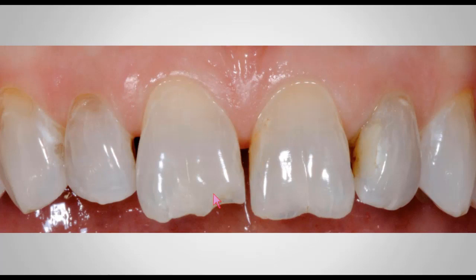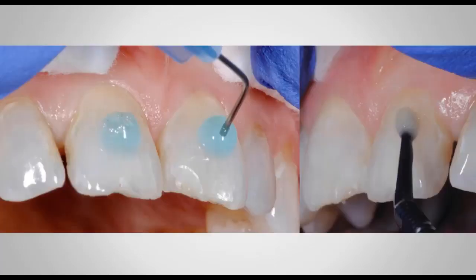So always think about that, and make sure that you do eliminate them if there's any before you do your prototype, because this is a very thin prototype and the composite will be a little bit translucent in the areas where it's going to be thinner. So once I'm ready and everything is ready for me to go, everything has been done in the lab, I'm ready to do the clinical aspect.